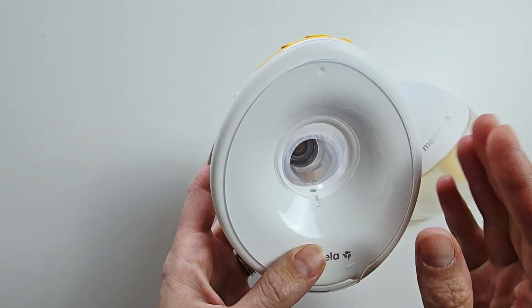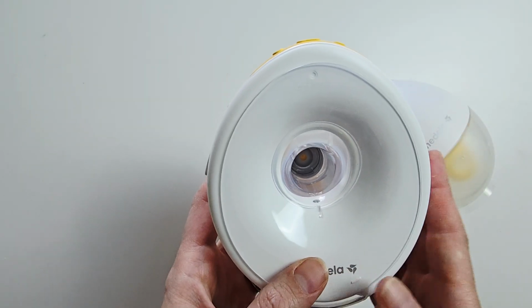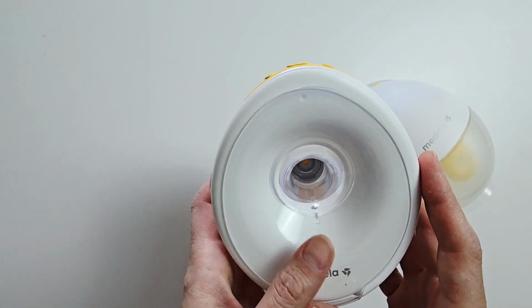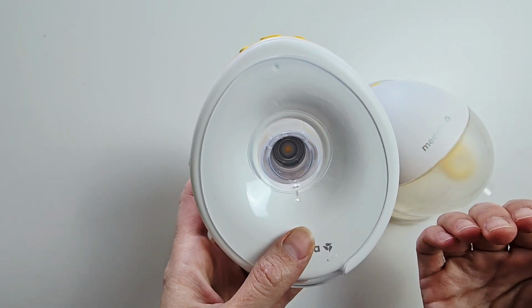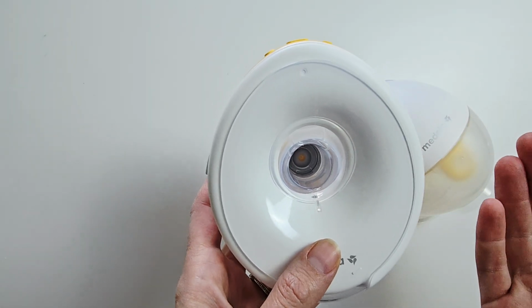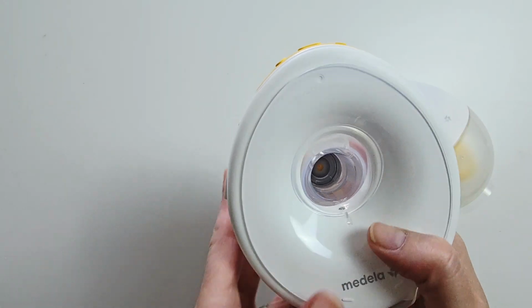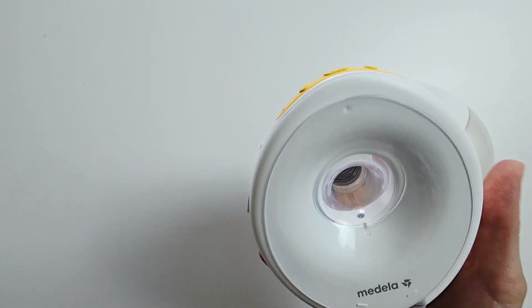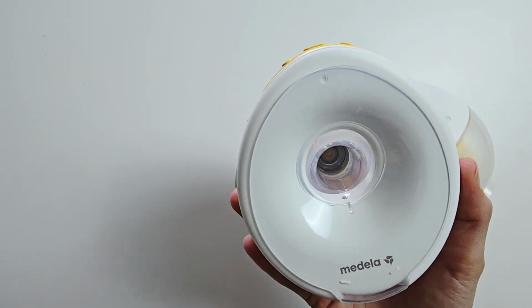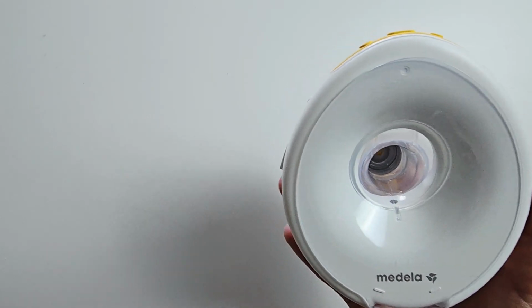This is designed to maintain some milk around the nipple area during your suction. So in here, you will have a little bit of breast milk pooling, and that is what this pump is designed to do. The concept behind that is it allows milk to remain around the nipple instead of immediately drawing away. The tissue stays more moist in a lubricated state, so it's designed to improve the overall comfort and maintain that suction at stronger levels. Basically, they're trying to mimic what your baby does with their mouth, with a little bit of breast milk inside.